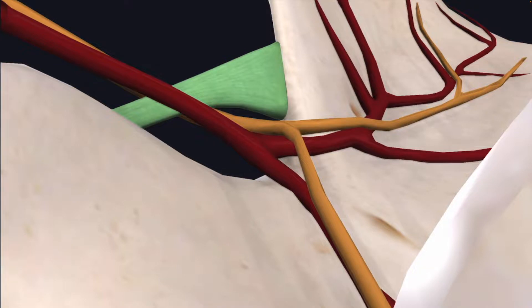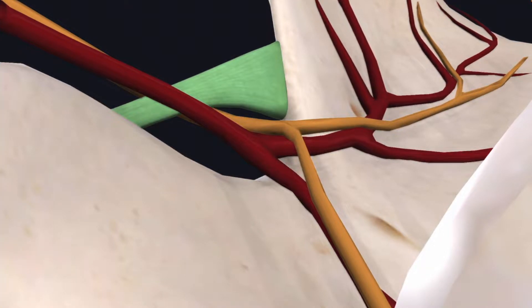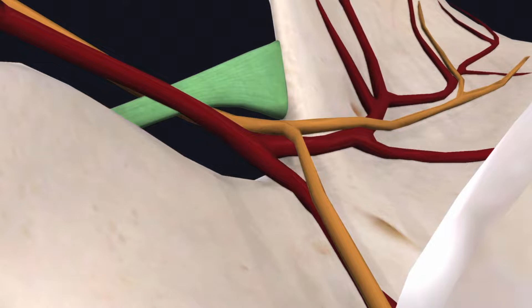Here we're looking at the superior transverse scapular ligament highlighted in green, and that's the site of compression in our patient today.